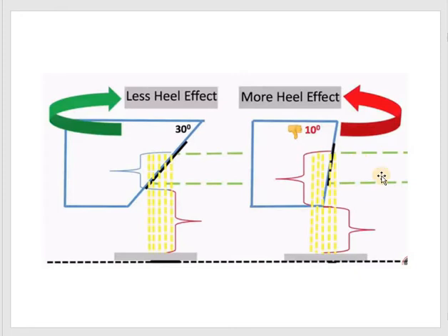Although the beam does not come in lines, let's say I quantify the X-ray beam into 5 lines. So there are 5 X-ray beams. Although we cannot quantify that in number, for this explanation I will. So this is a much bigger focal spot that produces a larger effective focal spot.